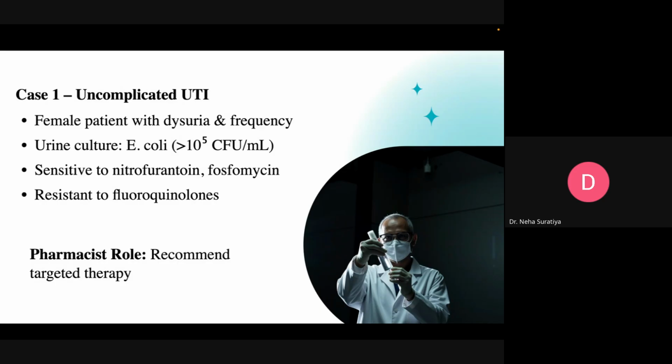Okay. And if it is confirmed that it is pathogen related, then you can go to antimicrobial sensitivity testing or to your antibiogram, and it will show you the percentage. For an example, the AST report will show you whether it is sensitive to nitrofurantoin, phosphomycin, fluoroquinolones, whether it is resistant to these things. Okay, AST will show you this, and your antibiogram will show you, if you want to use nitrofurantoin, how much percentage of possibility, reliability will be there to use nitrofurantoin in your hospital setting in the UTI.